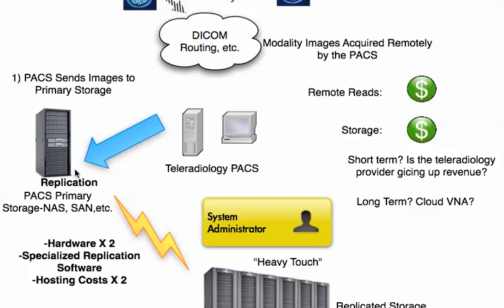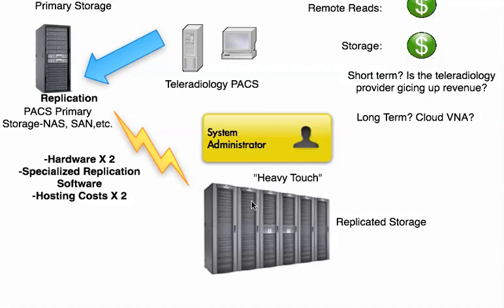A lot of teleradiology organizations strictly provide the diagnostic read as the value-added service. So the diagnostic studies might sit here for a short period of time and then be deleted. But there are others who provide this long-term archival storage. So typically you've got to replicate it again in a fairly heavy touch environment. It's turned into quite a nice profit center though.